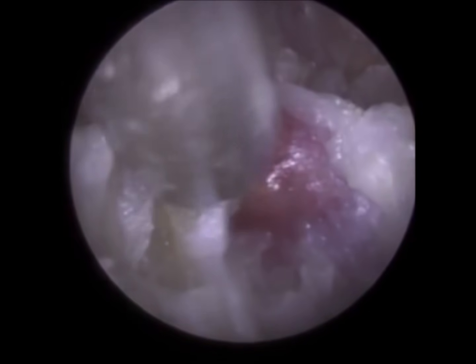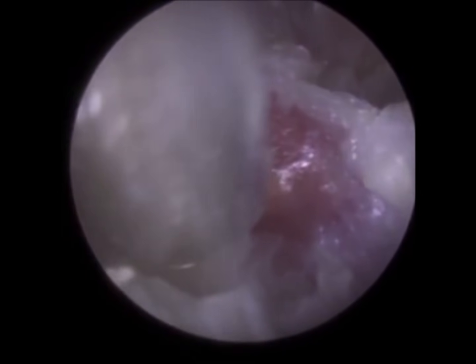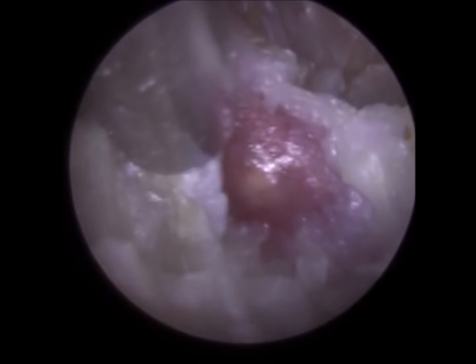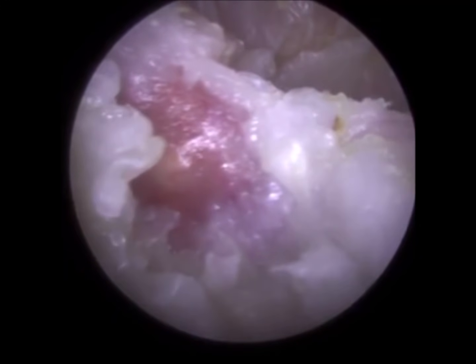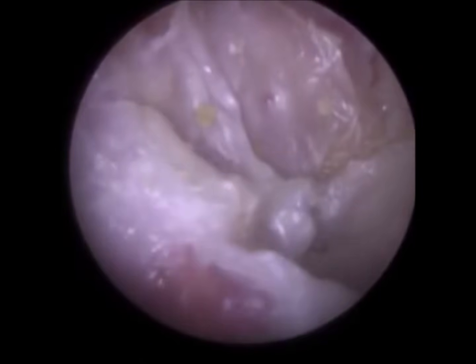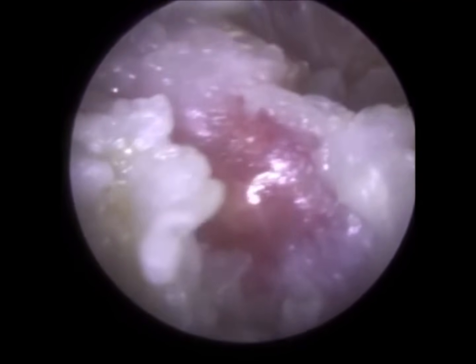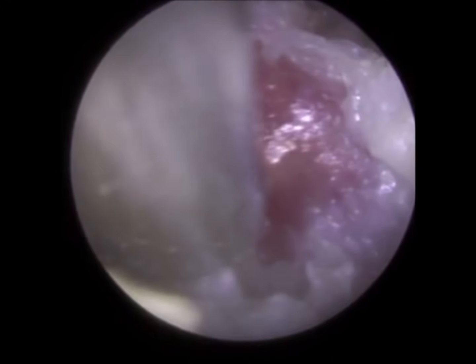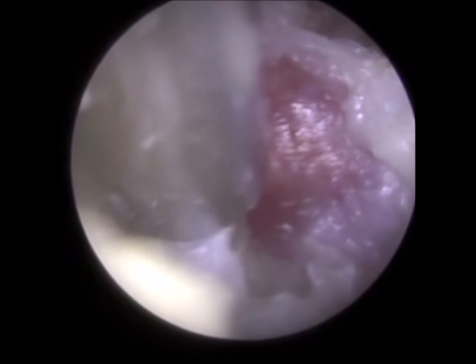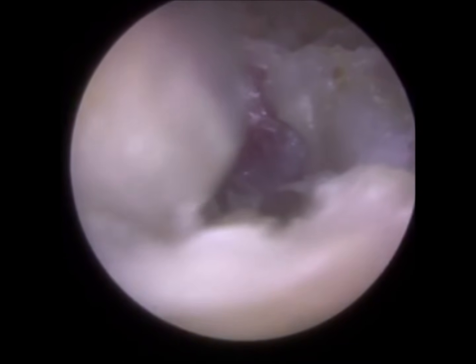Okay, so this is the second crater. It's right near the entrance, but on the left, on the back bit, and slowly but surely you'll see almost the perimeter of the original ear canal. You can just see a bit of flesh appearing just to the right of this on the suction probe. So that hollowing there, that's an erosion. Evident to the right of that fleshy bit was the original ear canal. So this is all additional volume of his ear canal that we're working in.